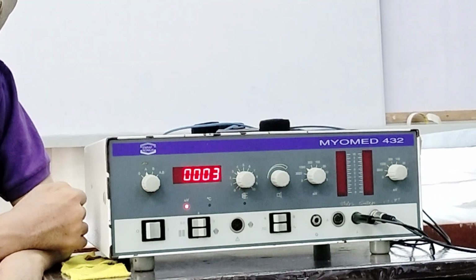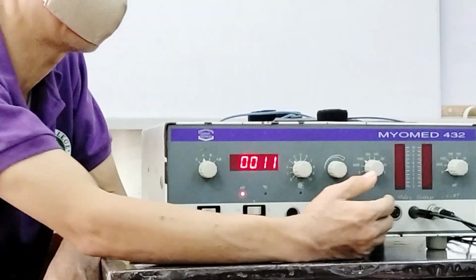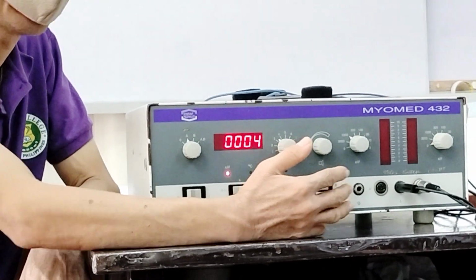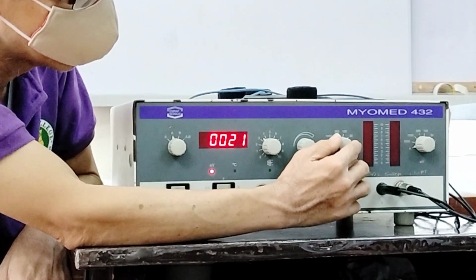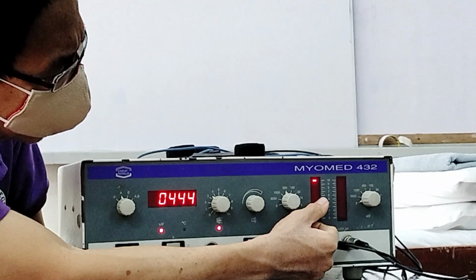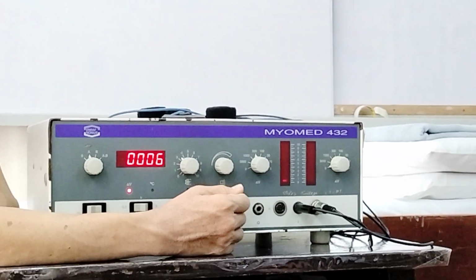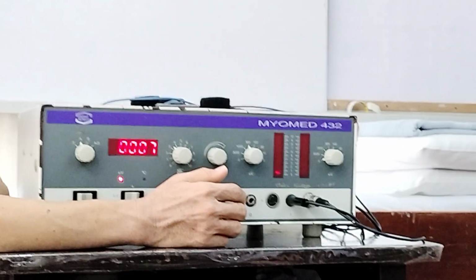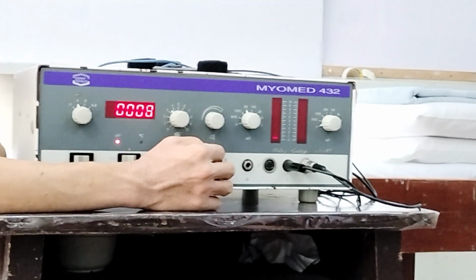So let's just say after you assess ang sa good side na kaya niya ang 300 microvolts, kaya niya ang 50% of the 300 microvolts. So therefore your affected side or involved side should have to also reach at that level.